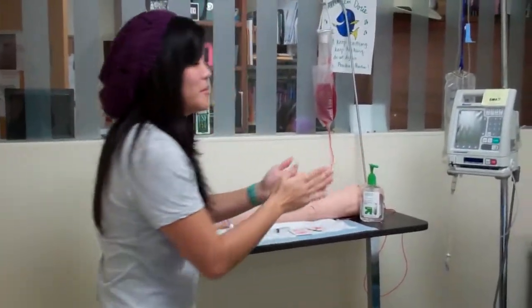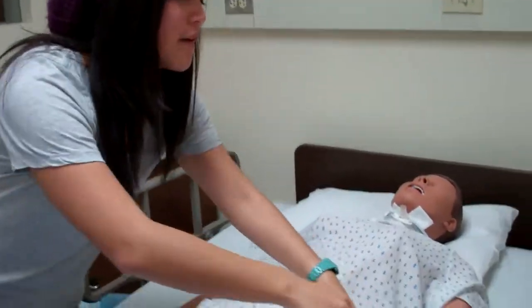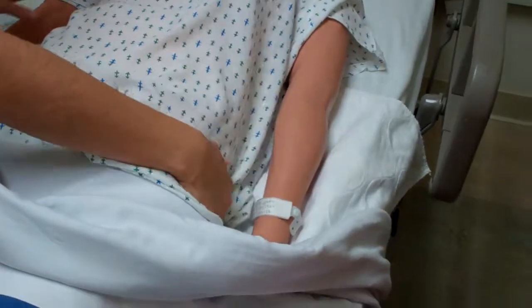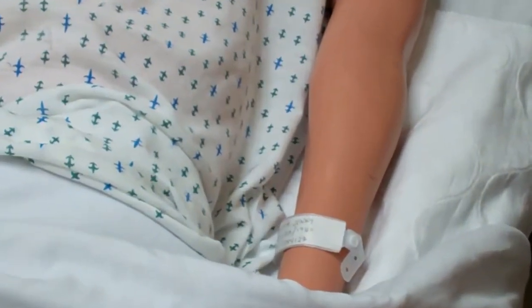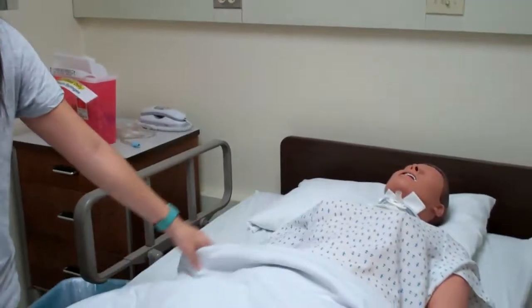Hi, my name is Allison. I'll be your nurse for today. Can I get your first and last name and your date of birth? If the child was too young, I could utilize the parent and ask them to verify the name and the birth date. Before I start, I just want to explain to the parent, if they're there, or to the child in simple terms, if they can understand, what medication I'll be giving them and how I'll be giving it to them. Let's just say for example I'm giving them Vanco, maybe to treat a urinary tract infection.